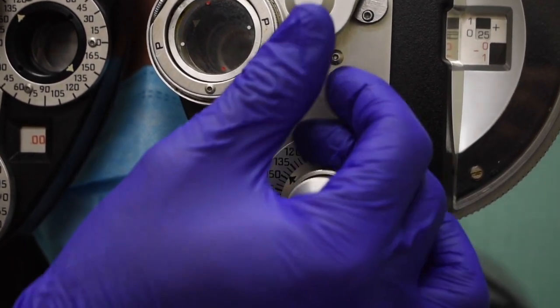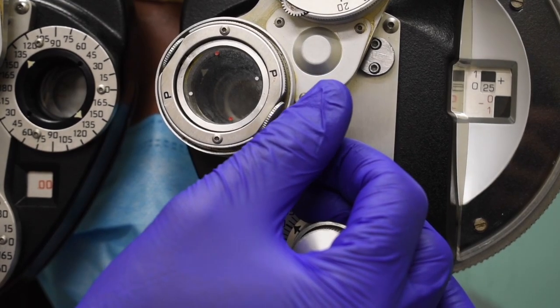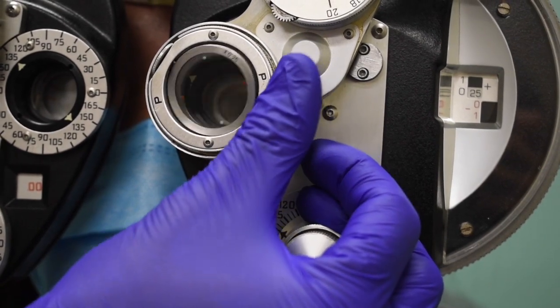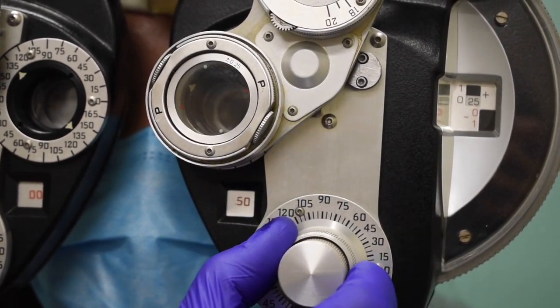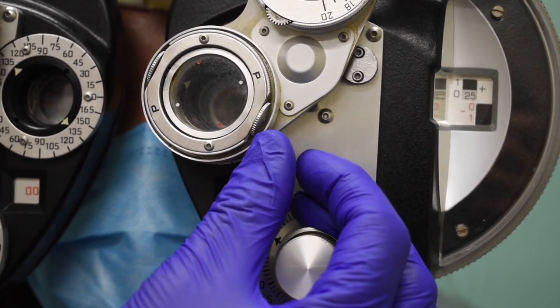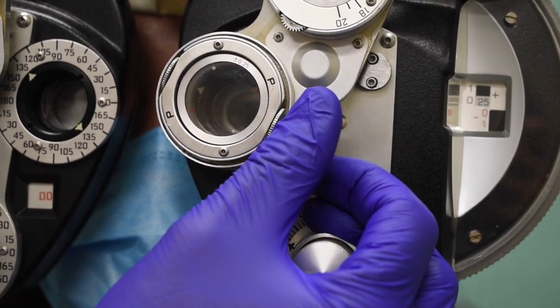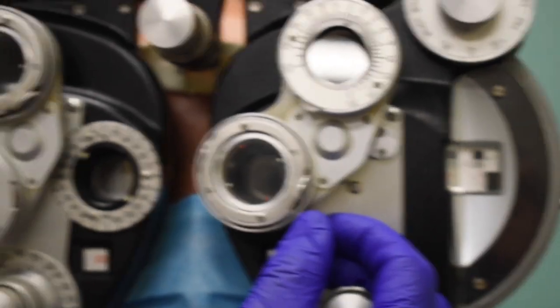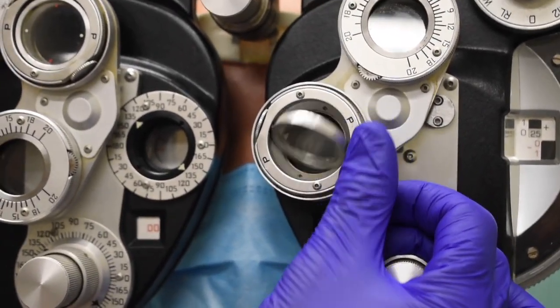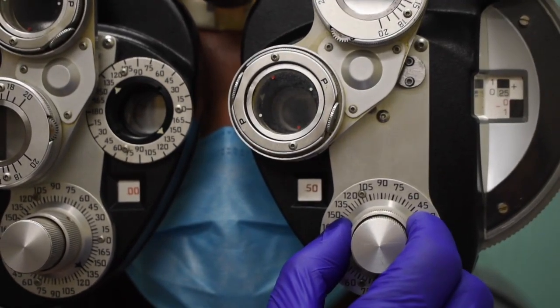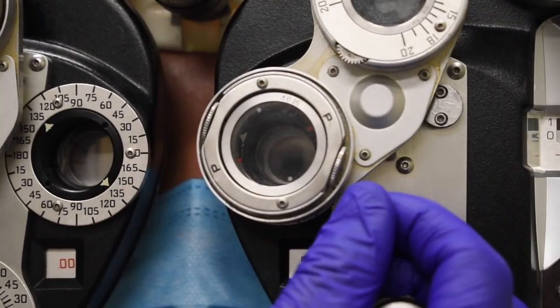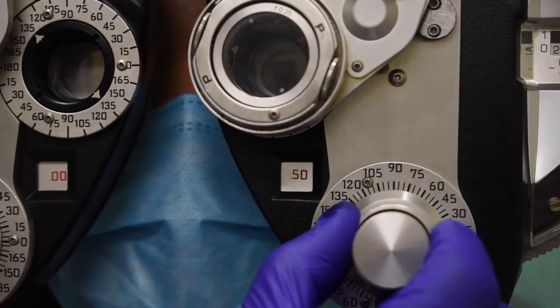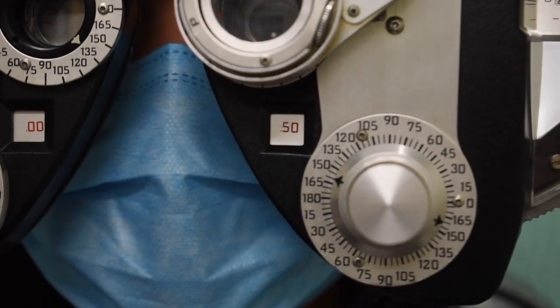Five degrees more. How about one here or two? One. Great. Now we'll go five degrees back. How about one here or two? One. And one here or two? Two. So each time I'm moving at about five degrees, one here or two. One. Now she's reversed again so I'm going to cut that in half. I'm going to go two and a half degrees. How about one here or two? One. And she reversed again so I'm going to go one degree back and that puts me at axis 160.